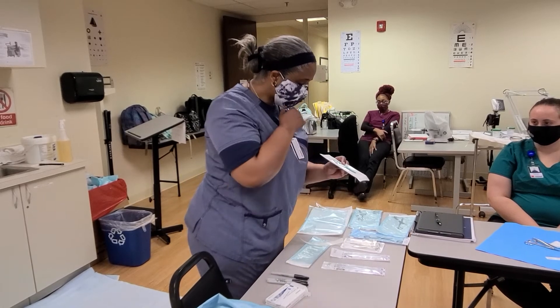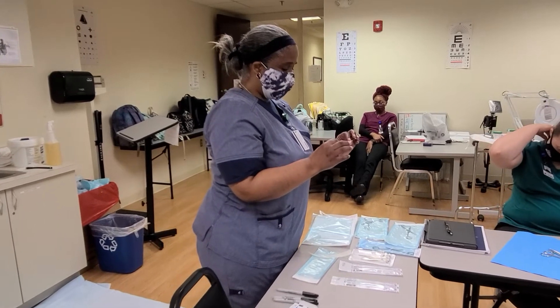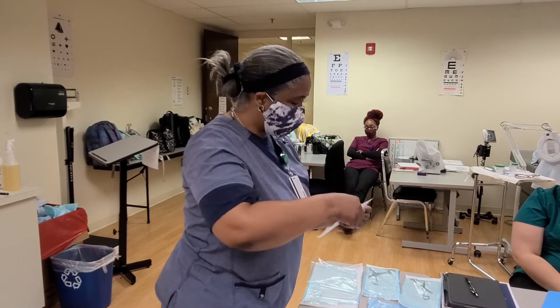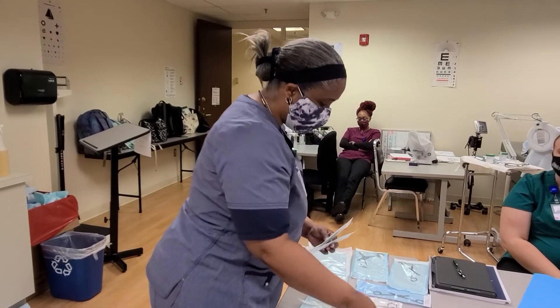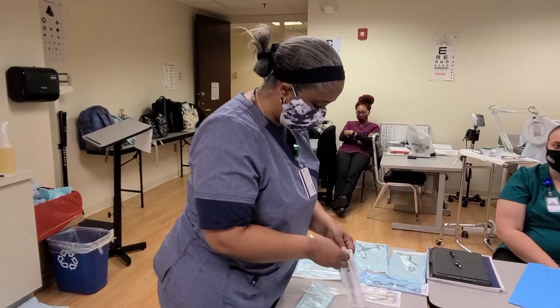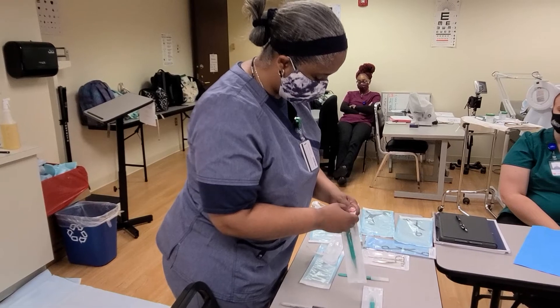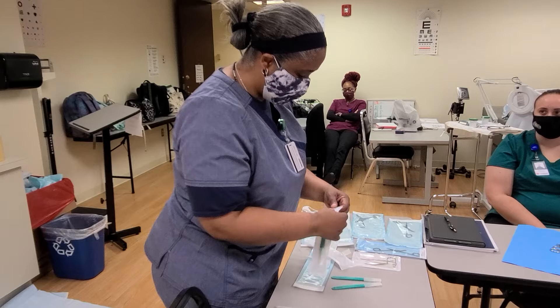We also have here different size blade handles — this is a disposable one, but it's also packed, so it's sterile. This one is the number 15, this one is the number 10, and this one is the number 11. They're all shaped a little differently, so I'm going to open them up so you can see the different shapes and why we would use different instruments for different procedures.